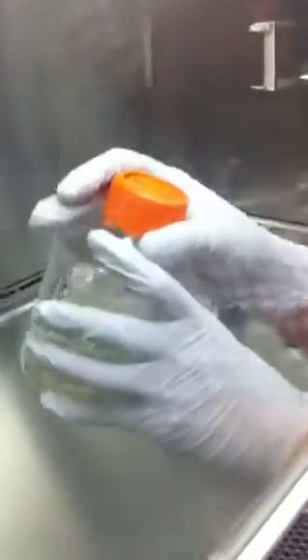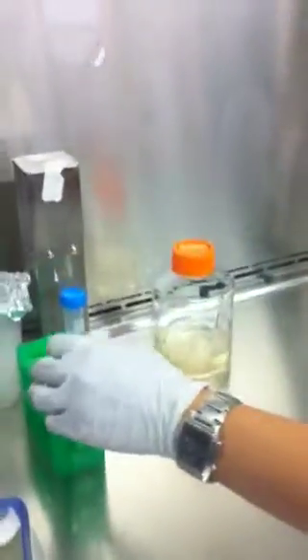You don't need to do it too much. It's just warm to the touch. It's not burning hot. So that's enough to sterilize. Okay. Turn off the fire always.